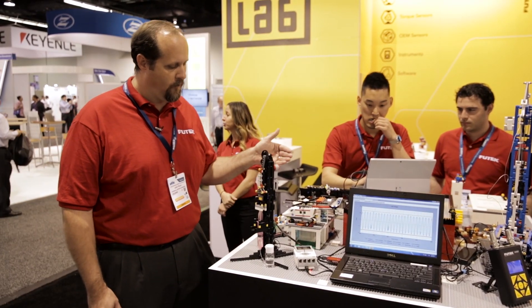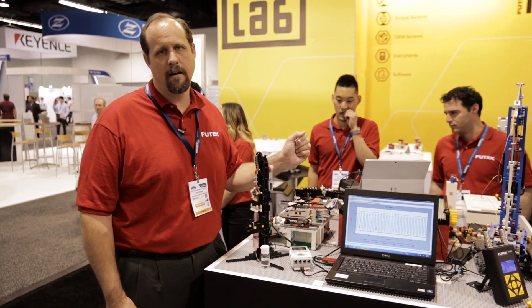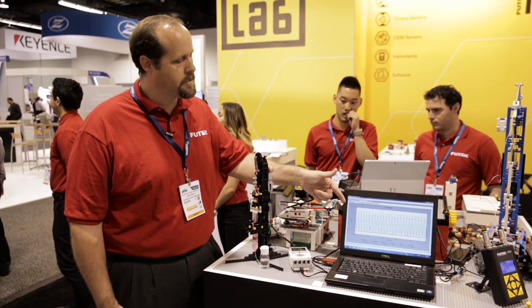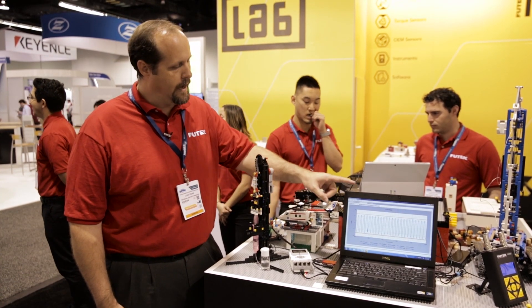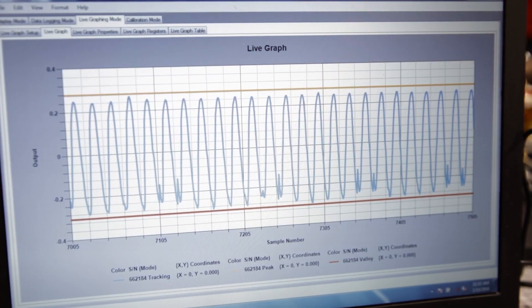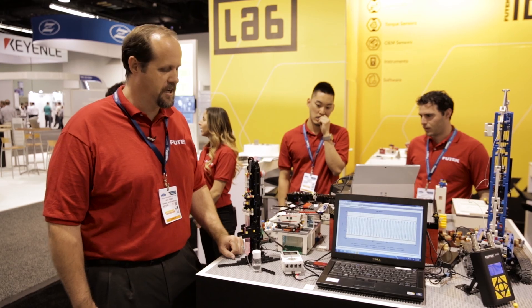We're taking the output from the load cell to our USB220. This particular one is our brand new all-metal housing with a slimmer design. We're also utilizing our proprietary Sensit software, and here you can actually see the peak and the valley. You can see that they're pretty much about the same, meaning that we are getting the same force on the syringe each time.